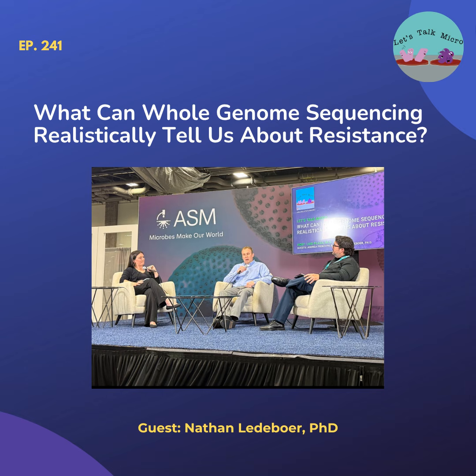So I think this emphasizes so many of the practices that we currently do. It brings pharmacy and microbiology closer. It brings epidemiology and microbiology closer. It brings infectious disease and microbiology closer. When you think about this from a patient perspective, you have a patient laying in the ICU. You complete your sequencing of the blood specimen that's sent down. You identify the organism as an E. coli, and there's an NDM5 that's present.